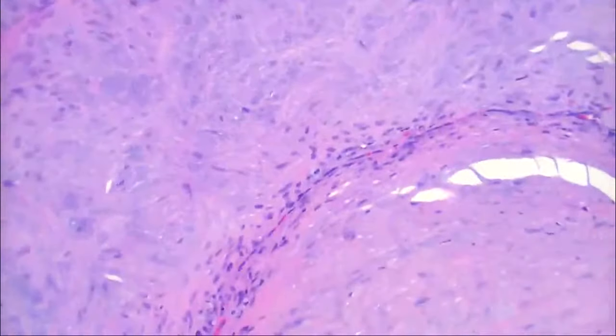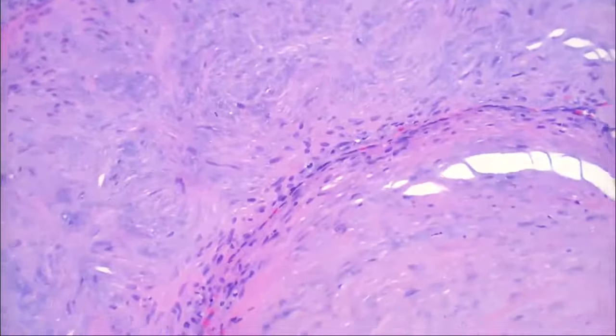Myofibroblast. Wonderful. So if you just look at this, it kind of looks like muscle, doesn't it? Yeah, it does. But if you look at this other stuff, it really doesn't look much like muscle. It looks more like fibroblast. So what's the diagnosis? Myofibroma. Wonderful.